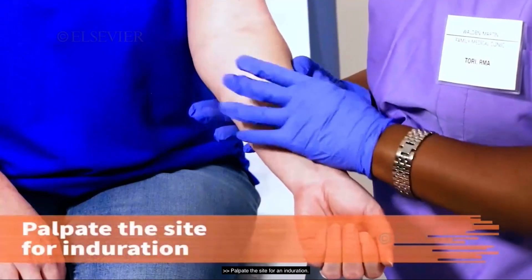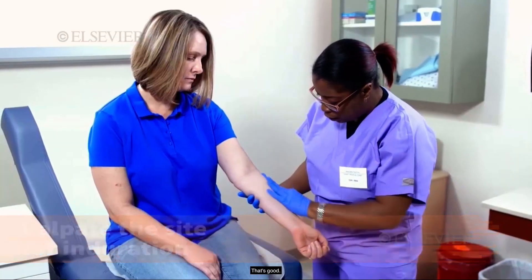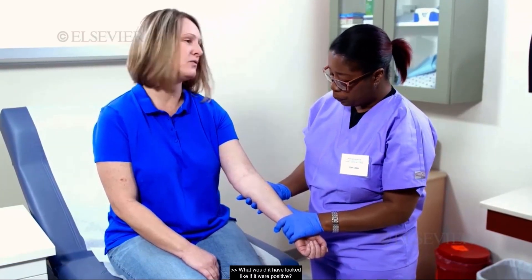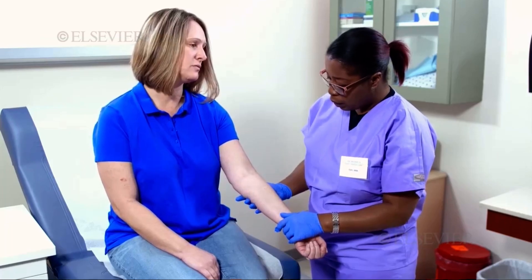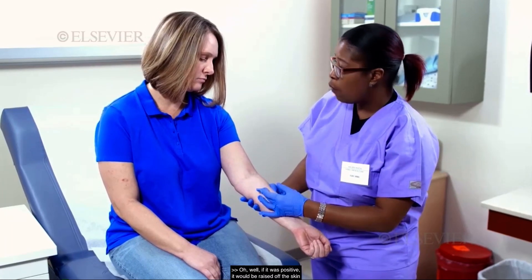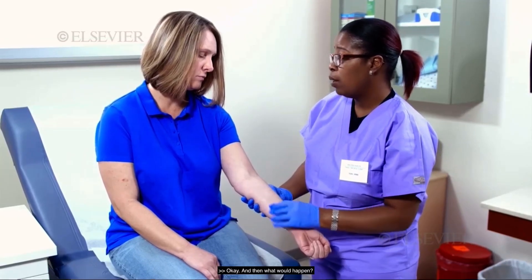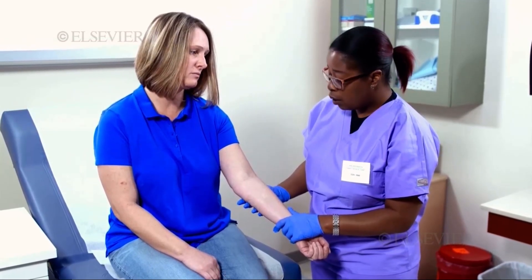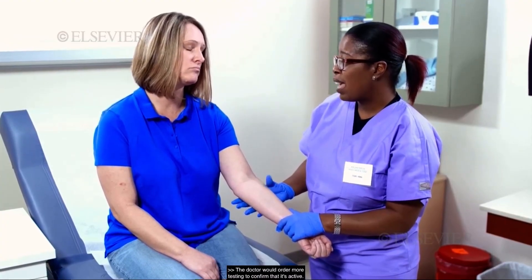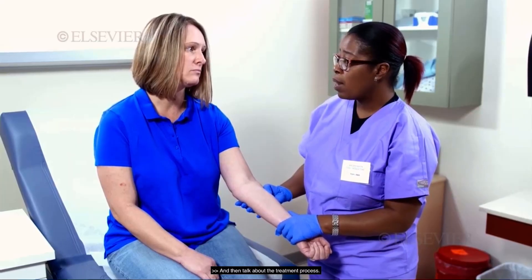Palpate the site for an induration. Everything looks negative. Do you have any questions? What would it have looked like if it were positive? Well, if it was positive, it would be raised off the skin with some swelling and inflammation. And then what would happen? The doctor would order more testing to confirm that it is active, and then talk about the treatment process.